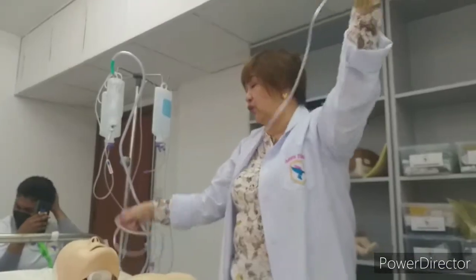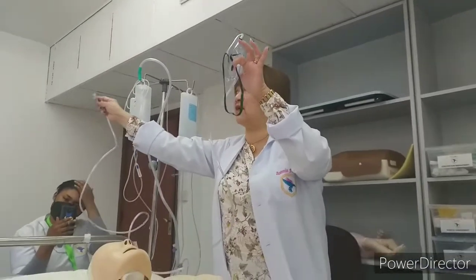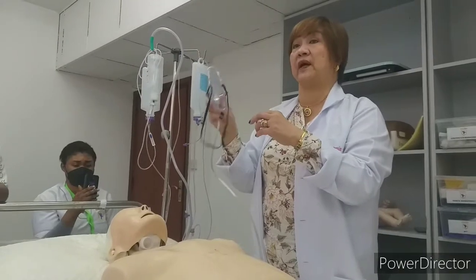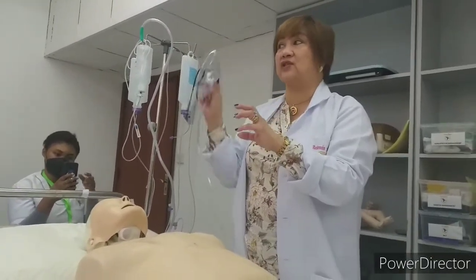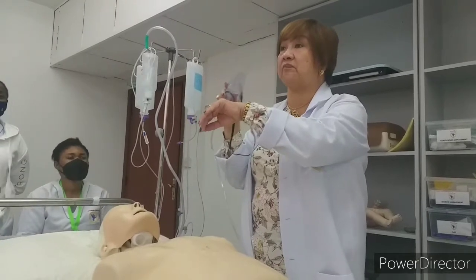Okay, so there is a tube. Connect this tube. Okay, so this is face oxygen mask. Connect the tube. Put onto 1. How to test? As we said, never do or give anything to the patient without checking. So we need to check. How to check it? Put it to the cheek, or face, to the skin. So you need to feel something there.